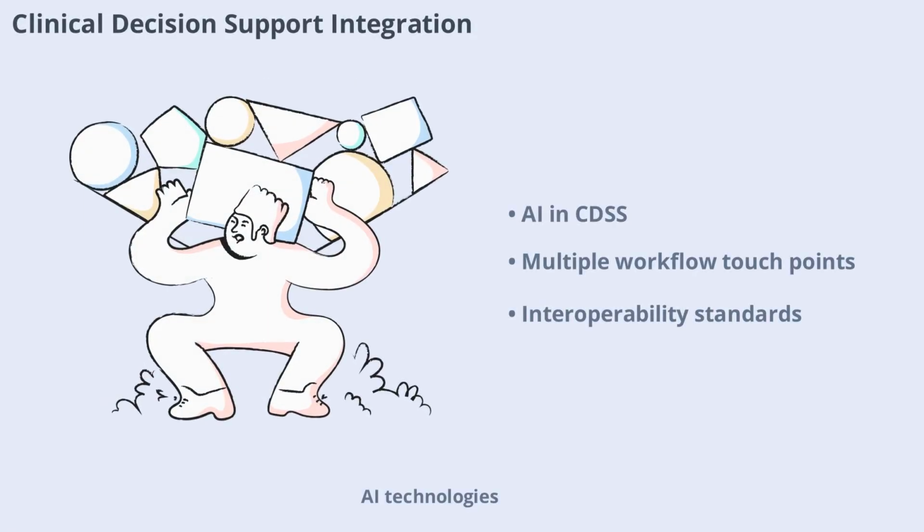AI technologies, including machine learning and natural language processing, have revolutionized clinical decision support systems, CDSS. These systems process patient data, recognize patterns, and provide actionable insights. AI can be integrated at multiple touchpoints in the radiology workflow, from image acquisition to reporting and storage. Interoperability standards like DICOM and HL7 are crucial for seamless integration across diverse healthcare systems.